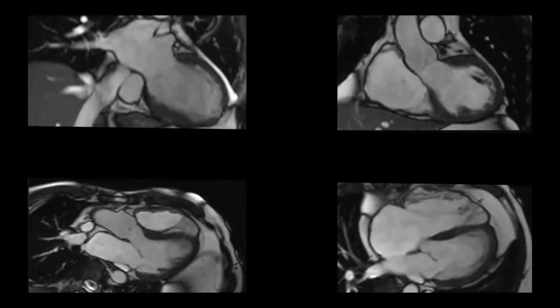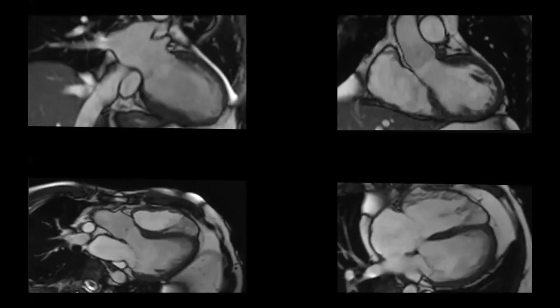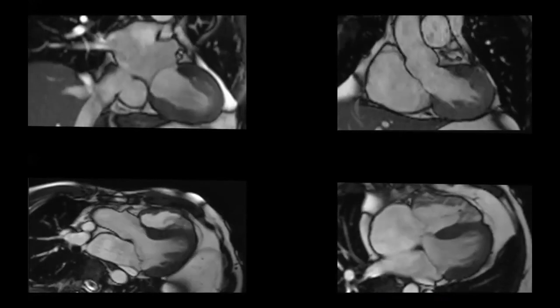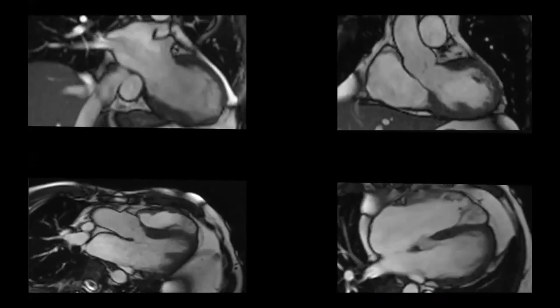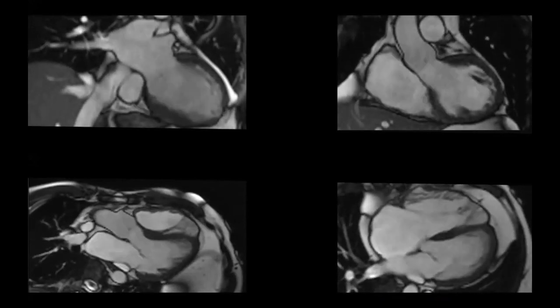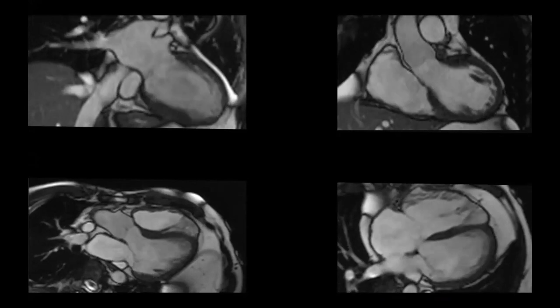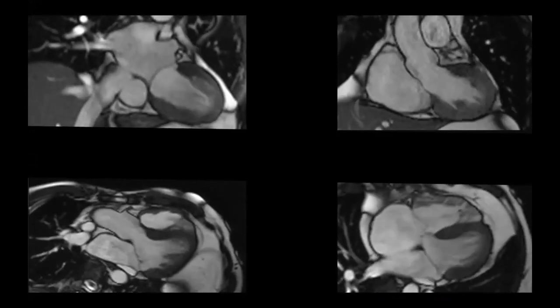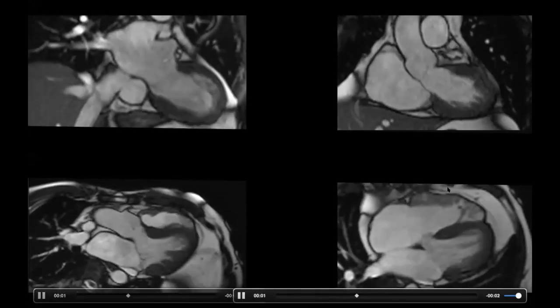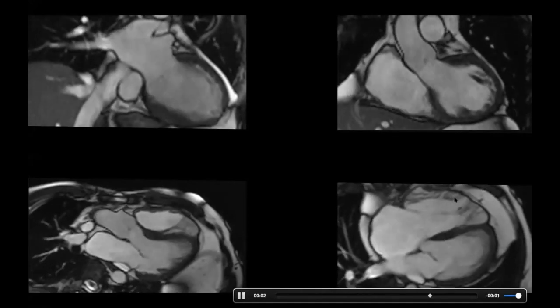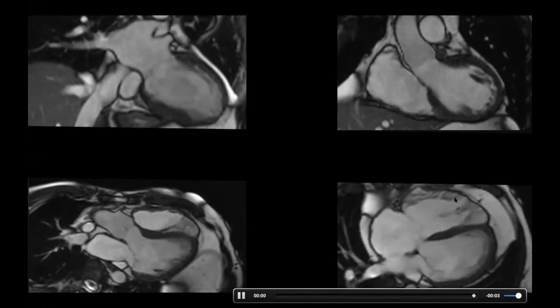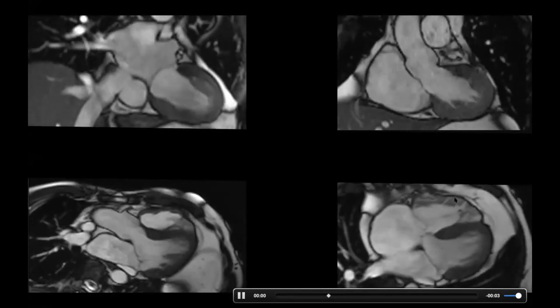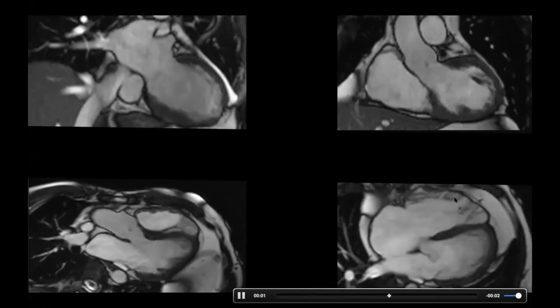How do we look at the function? These images represent one patient, with each image being a representation of one heartbeat, taken during one breath-hold examination of 6 to 12 seconds depending on heart rate. You can see the contraction of the ventricles and valve opening and closing very well. The right ventricle free wall can be very nicely seen — there is no problem with poor acoustic windows whether the patient is obese, has scoliosis, or has surgical dressings on the chest wall.